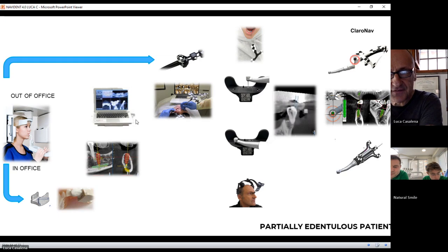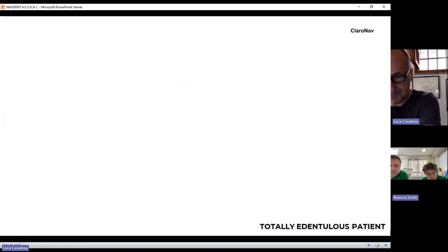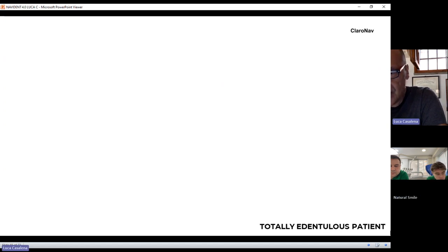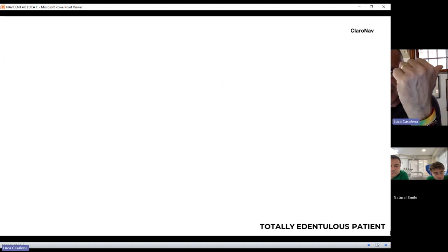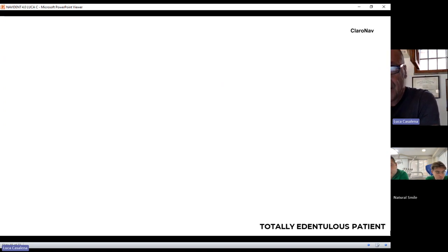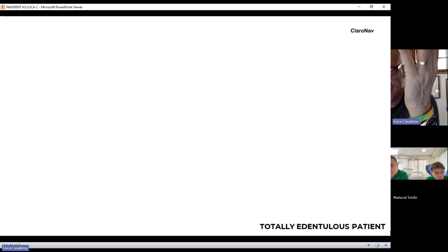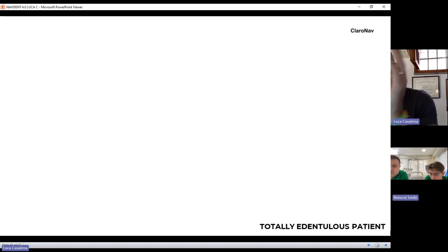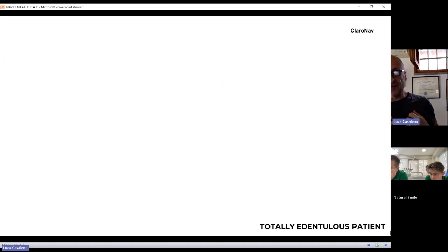Let's explore the second protocol — the totally edentulous patient. Navident works perfectly for all different cases: you can work with totally edentulous patients, place zygomatic implants, pterygoid implants, and nasal implants — cases that are more challenging because of limited bone volume. The advantage of Navident is that you pinpoint the limited volume to place the implant in a way that is congruent with the prosthetic project for the patient. This is a prosthetic-driven surgery.